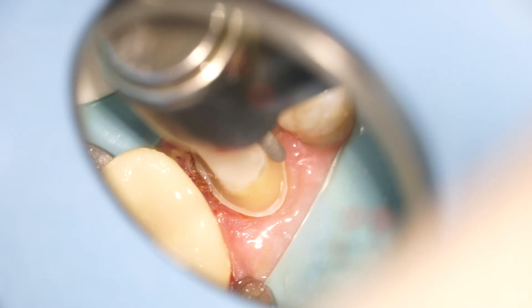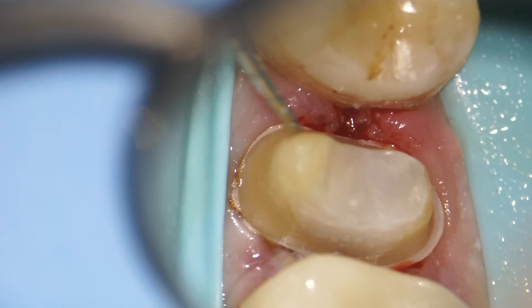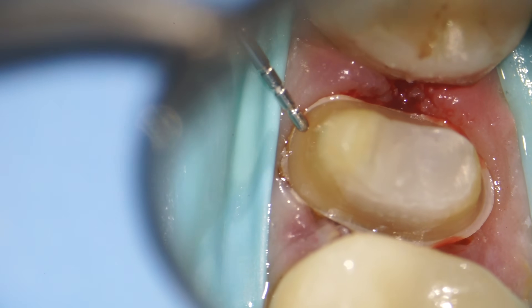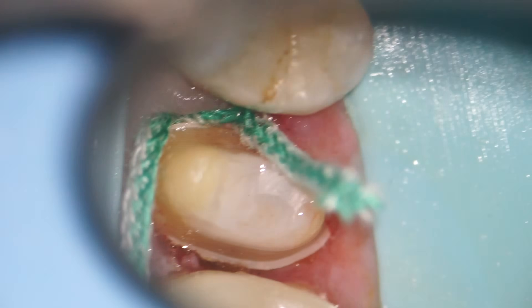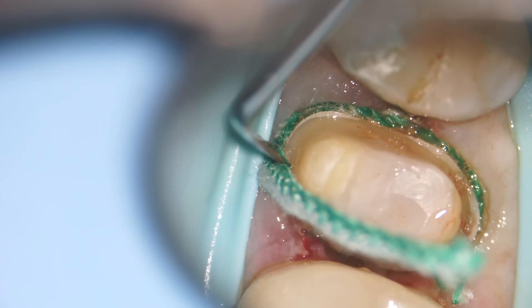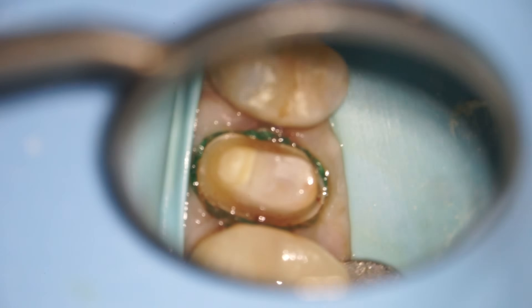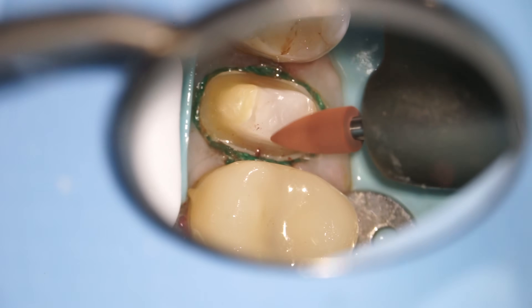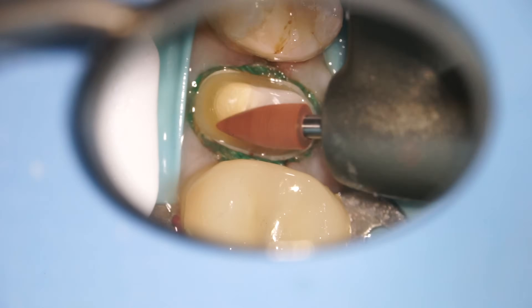Once that's done, we check our reduction — about 0.6 millimeters and 0.6 millimeters, which is perfect. Then I put another cord in place to make sure that the gums are way out of the way so that when we take our digital image of this tooth, we get a really clear picture. We're going to polish everything up now to make sure it's nice and smooth and just perfect for the lab who's working on it.